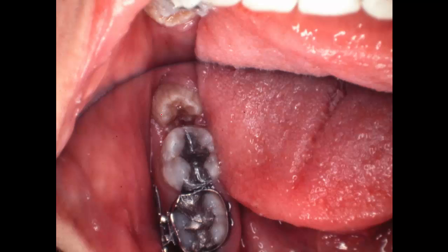There you're looking down at it from the occlusal surface. When I bonded the wire down in here, I had to be very careful not to get in the acrylic and bond this tooth to the other tooth to do that. And I took a picture of the spring, and it came back. This is when you just had photographs and no digital cameras.